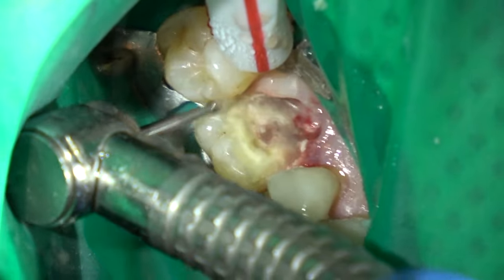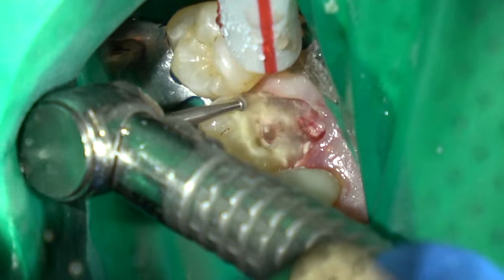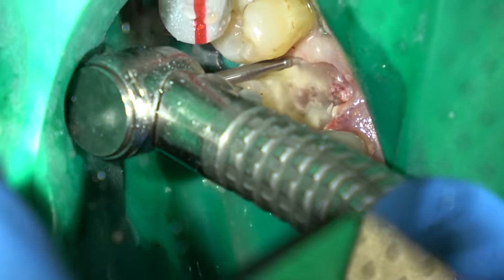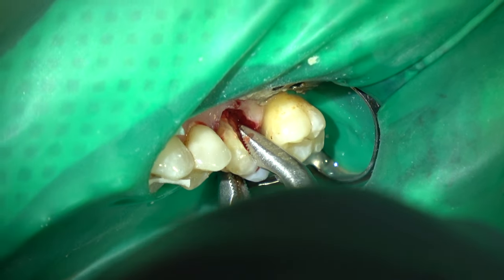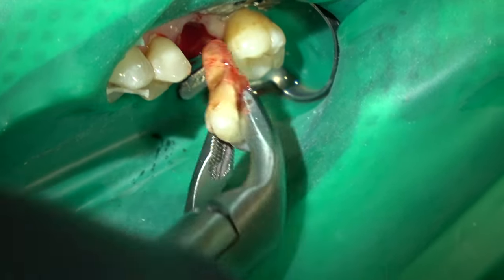Be careful not to touch the adjacent tooth. Again, this is that long shank number four or number six surgical burr — number four because you don't need a lot of space, but cut all the way through the contact. Then I've got space here and very gently just unscrew it. It's like taking out a single-rooted tooth.